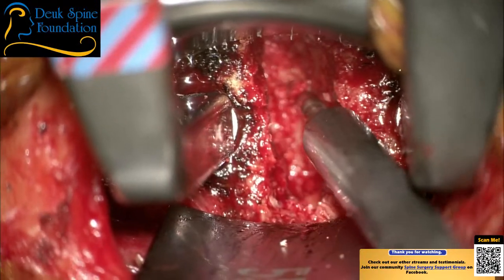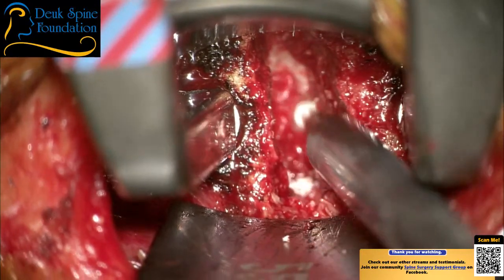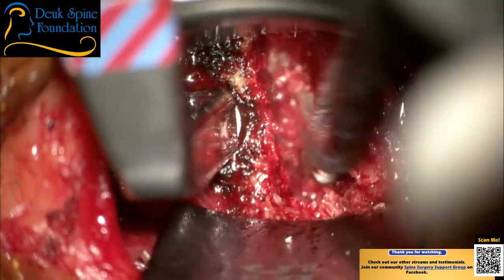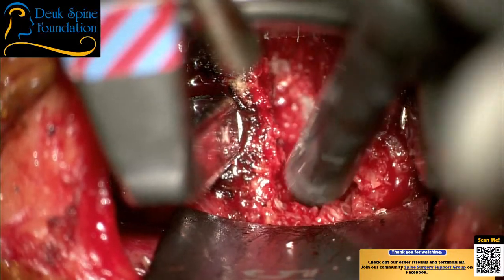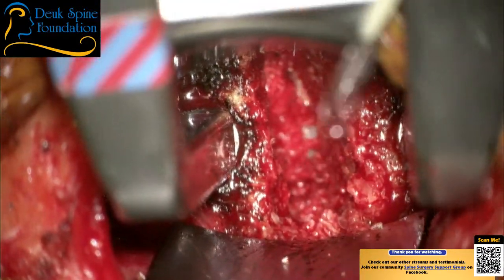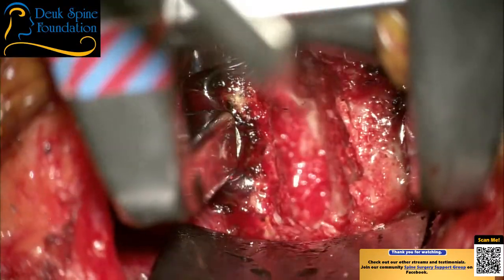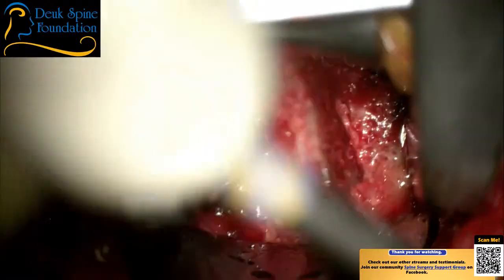Cytokines. There's a bone spur right there. You see that? Herniation. The soft stuff is herniation. Remember, what happens to herniations over time? Is that they calcify, they get hard, they turn into bone spurs. Curette?